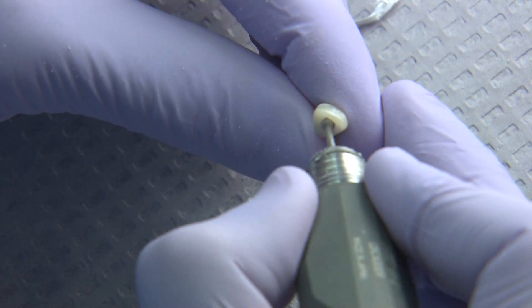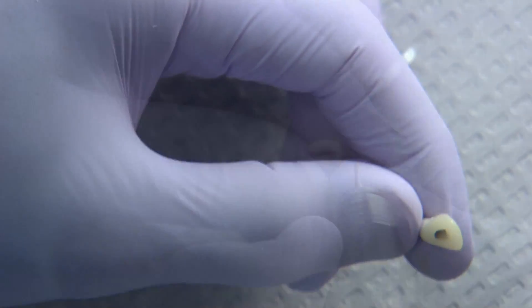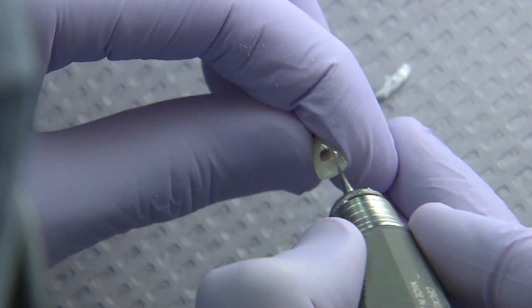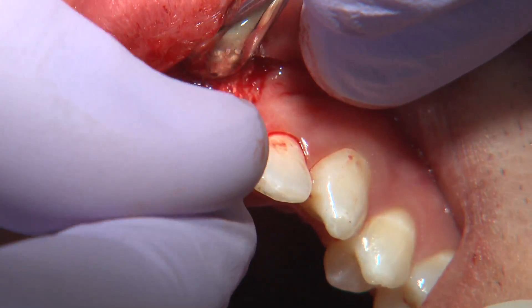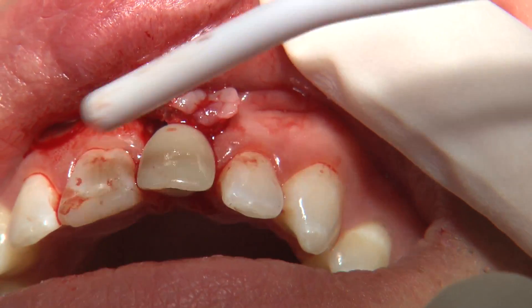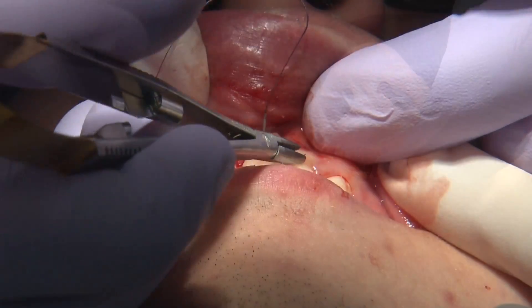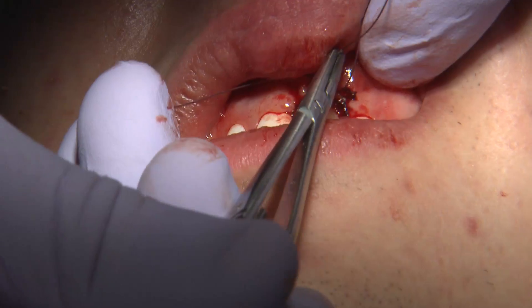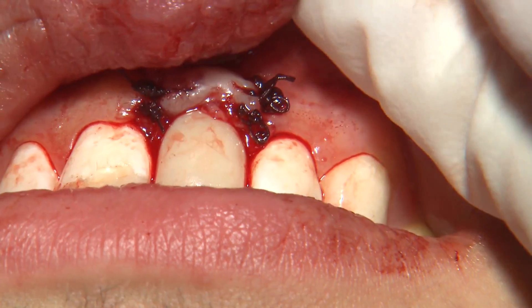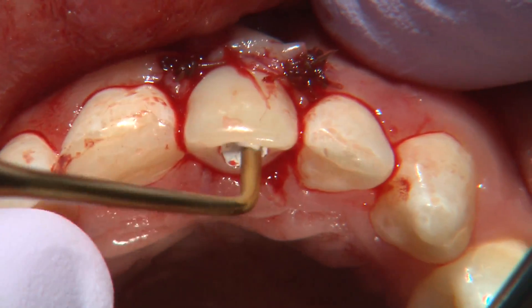When the patient comes back at a future date, we can visualize how well the papilla has formed around that temporary. I deliver the temporary crown and temporary abutment as one unit in a screw-retained restoration, then place sutures. The patient then goes through a period of healing and osseointegration. With immediate loading, you have to be very careful, and we give the patient instructions on how to take care of the temporary restoration — it cannot be treated like a permanent restoration.